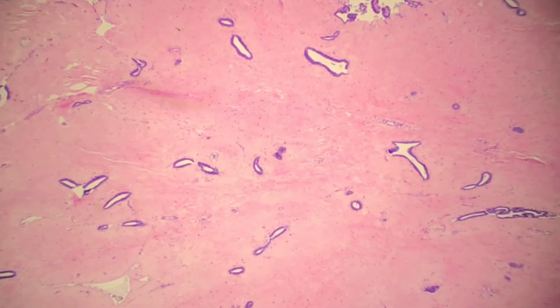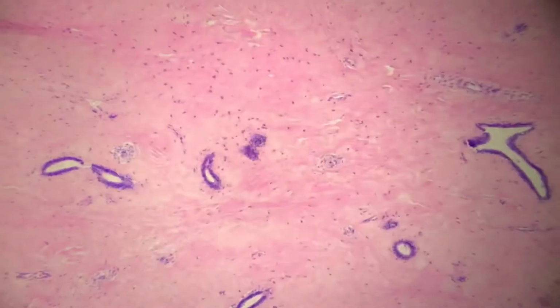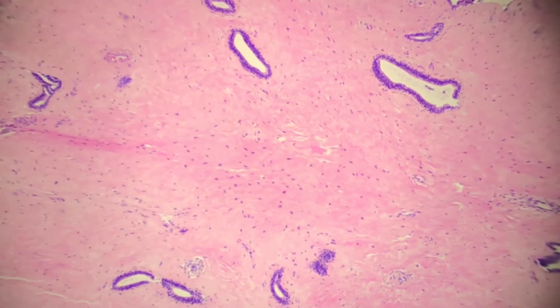And you get the sense that these are relatively pink tumors, right? We have some glands in there, but it's generally a sea of pink, okay? And fibroadenomas are biphasic. So first, if we look at the stroma, which is all the pink areas, what we see generally, even at low power, and with these you always want to look at low power first, is that there's not a lot of cells. It's relatively hypocellular, it's somewhat loose, and nothing is overtly scary looking at 4x.